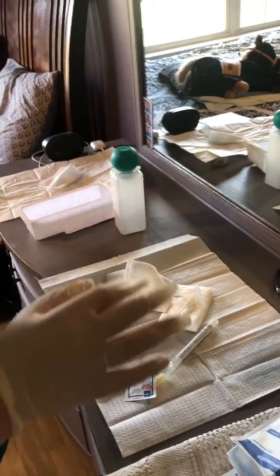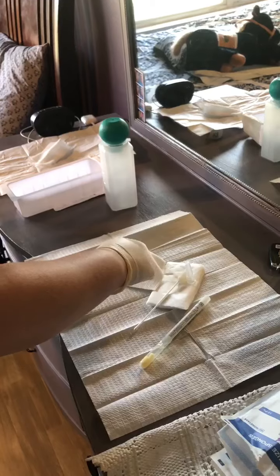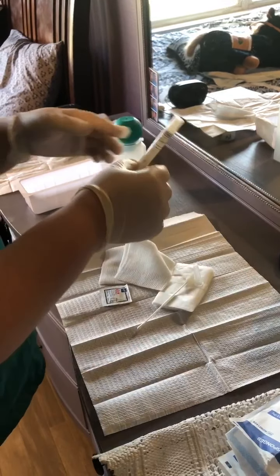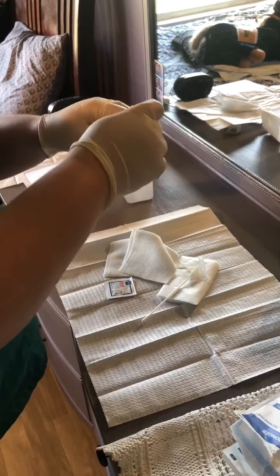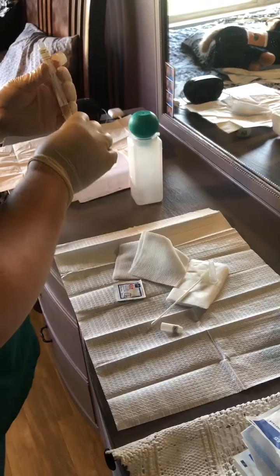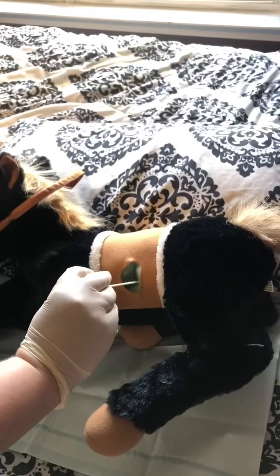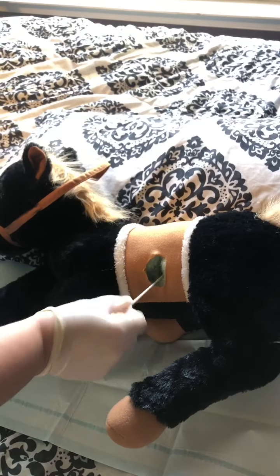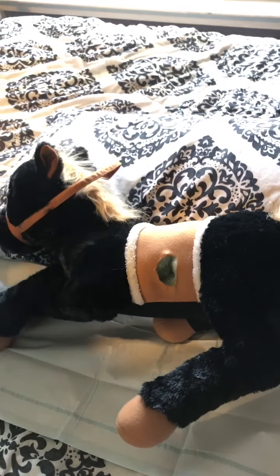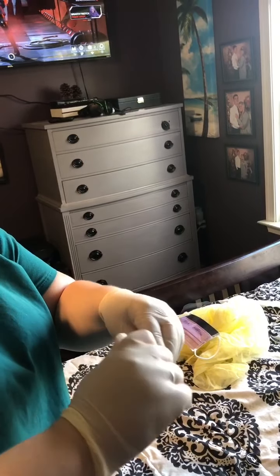So now it is dry enough for me to collect my sterile swab. So I'm going to take it, remove the cap. So the cap is still sterile. So I'm going to take my swab. I'm going to come over and I'm just going to swab, circle around the best part of the wound that I think we could get a good culture. And be careful not to touch the inside or the outside. I'm going to come back over and put the cap on.